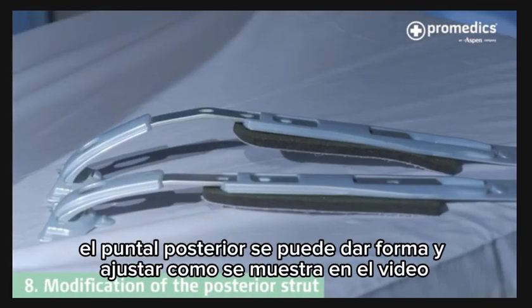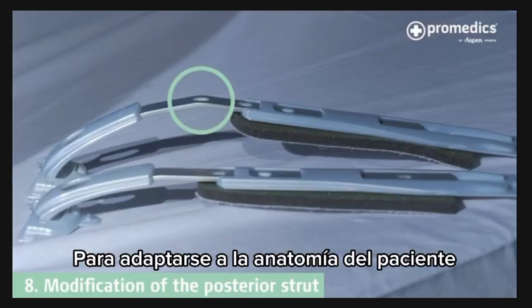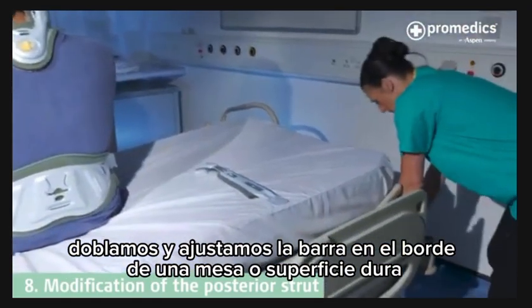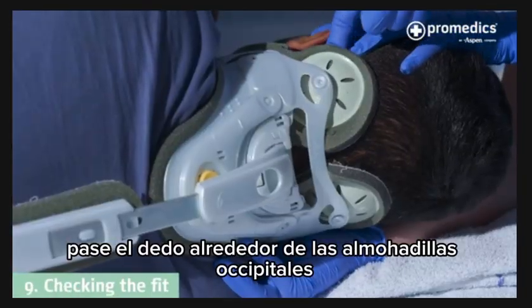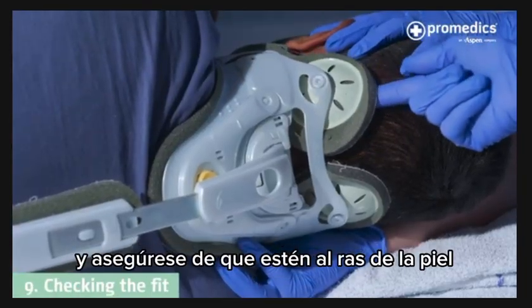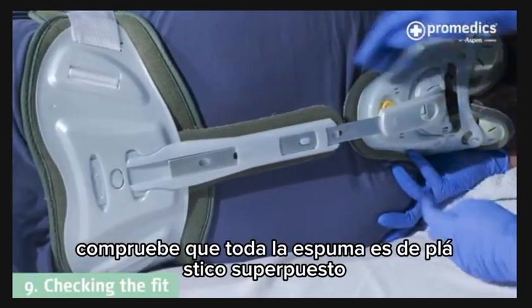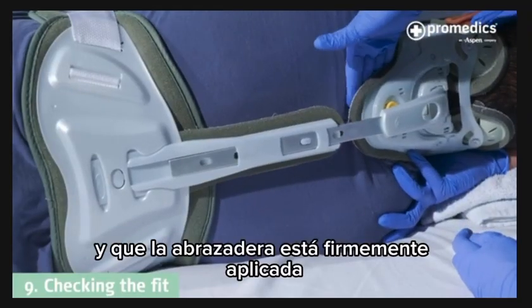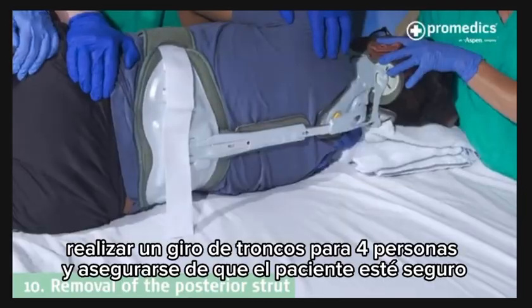The posterior strut can be shaped and adjusted as shown in the video to suit the patient's anatomy. To do this, we bend and adjust the bar on the edge of a table or hard surface. Run your finger around the occipital pads and ensure they are flush to the skin. Check that all foam is overlapping plastic and that the brace is firmly applied. Perform a 4-person log roll and ensure the patient is secure.